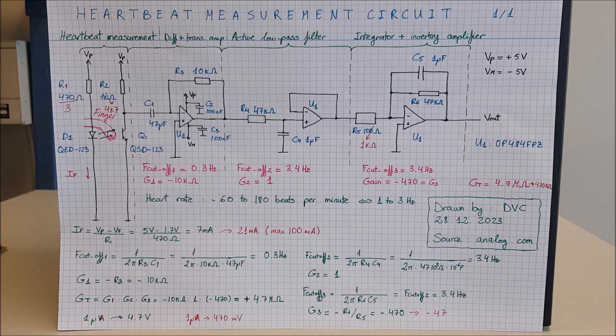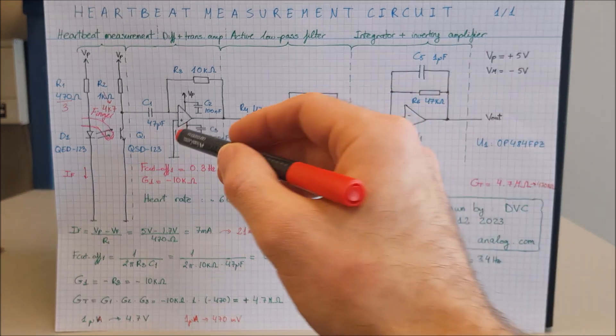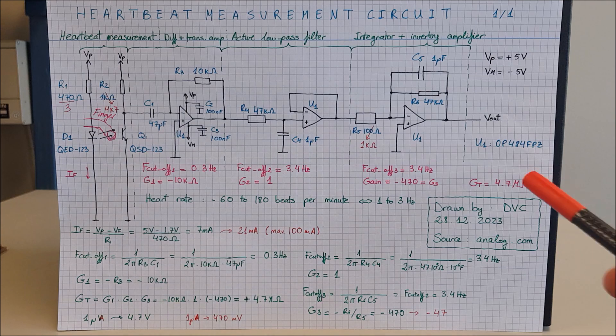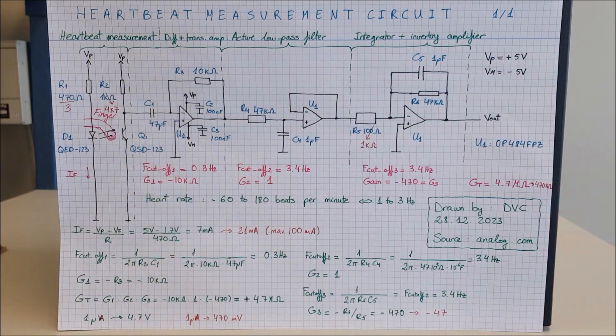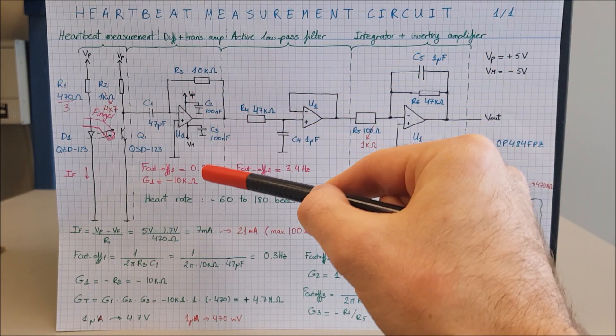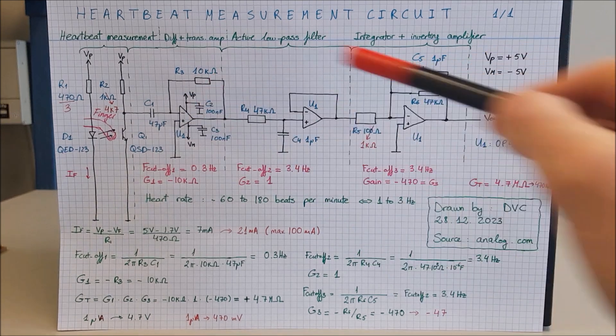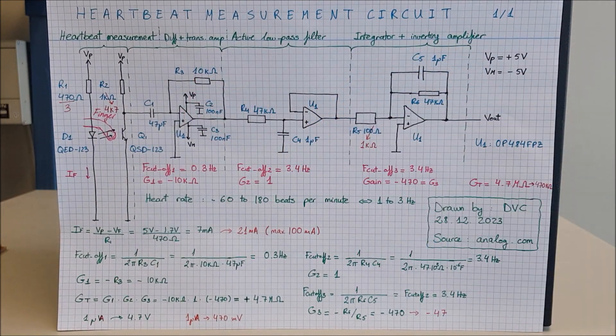Now all these triangles are the same operational amplifier, an OP484. I have bypassed it with 100 nF capacitors C2 and C3 and this is powered from plus minus 5 volts.